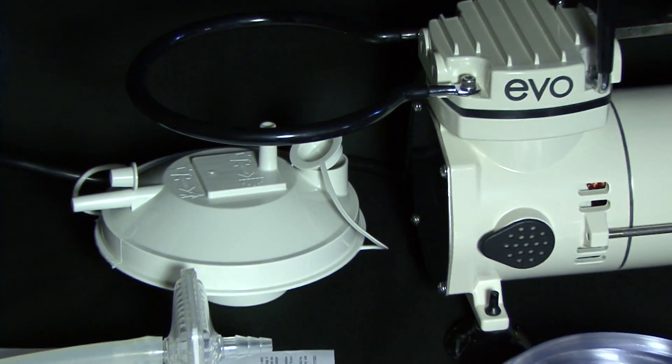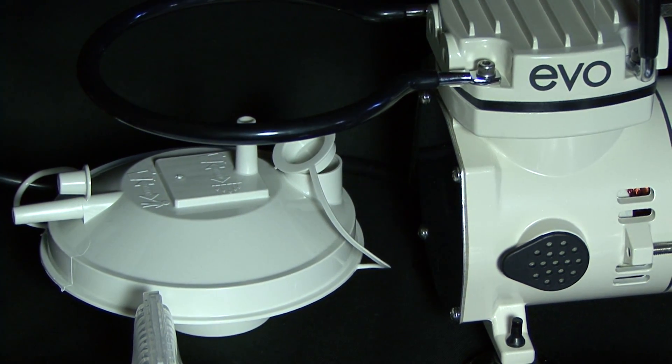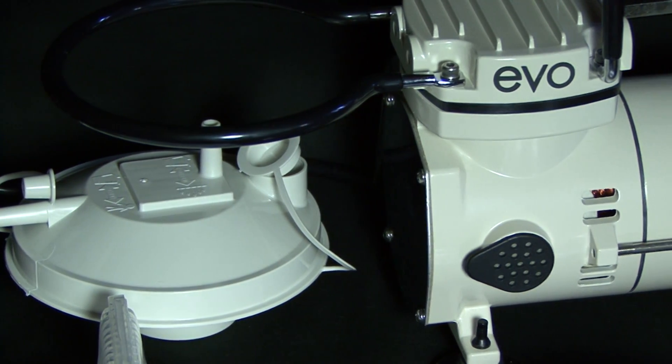Before each use, inspect the suction pump and the accessories for damage or wear, and replace as needed.